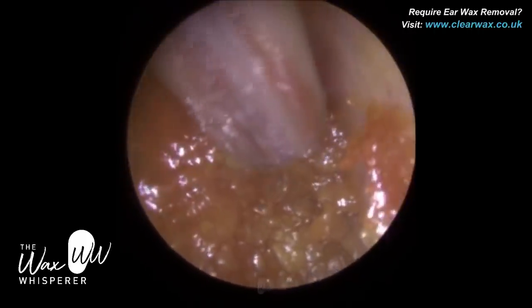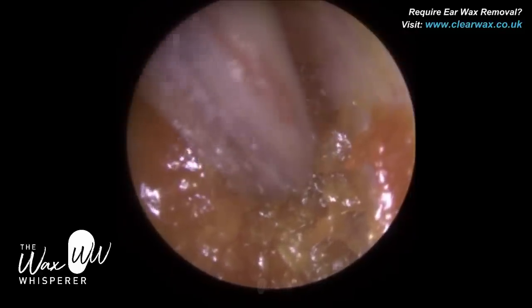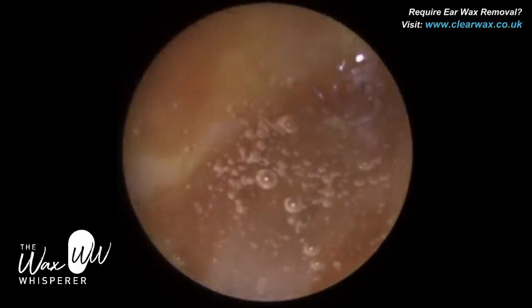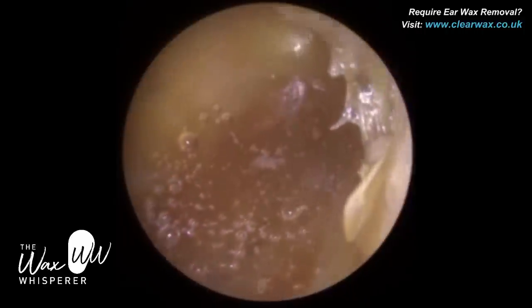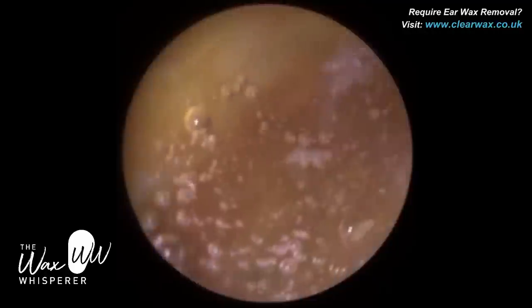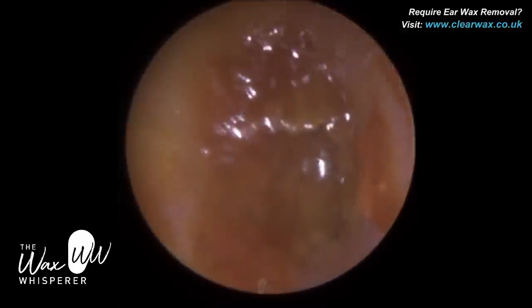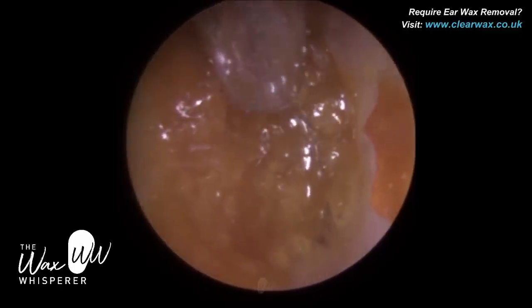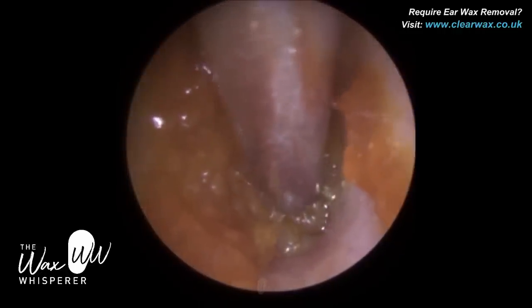So when you go to the doctors and they look into your ears, typically they use an otoscope with a disposable black funnel plastic tip attached to the end — that's inserted into the ear. It's single use and disposable. So when people perform microscopic earwax removal using a microscope, head loops, or an otoscopic approach, a speculum is inserted into the ear and that immediately narrows the field of view and also the freedom of operation you have with the instrumentation.